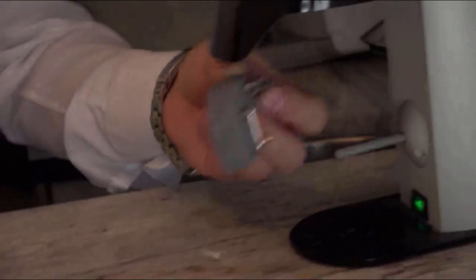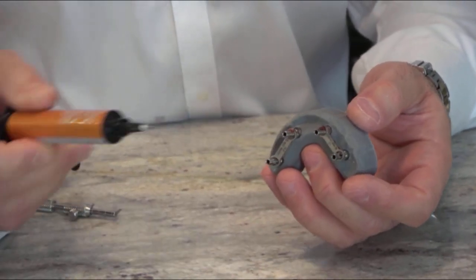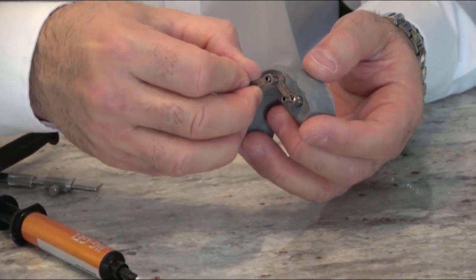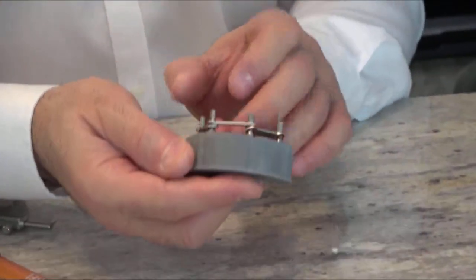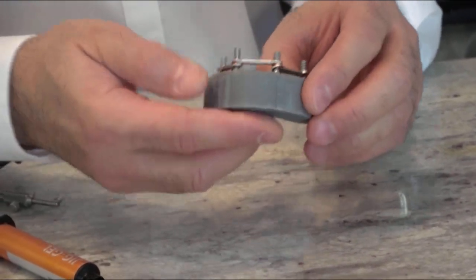When you put it on top, it's going to lock in. See, it's actually stuck together now, and then we cure it.